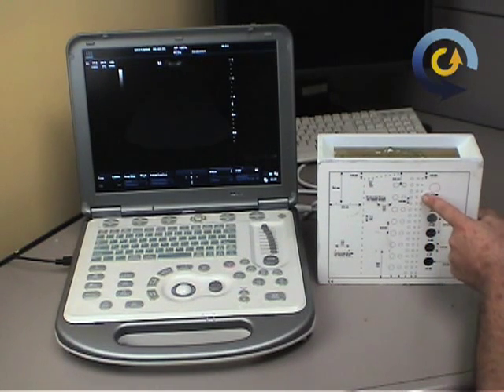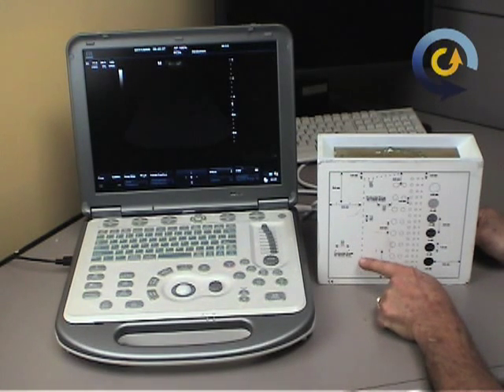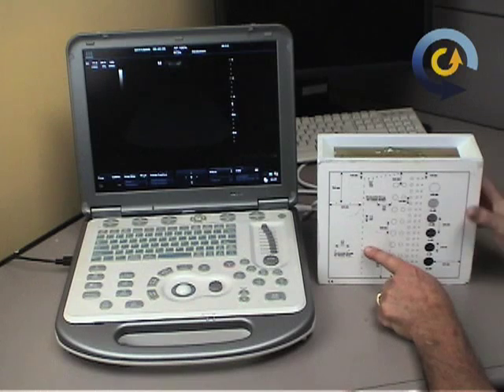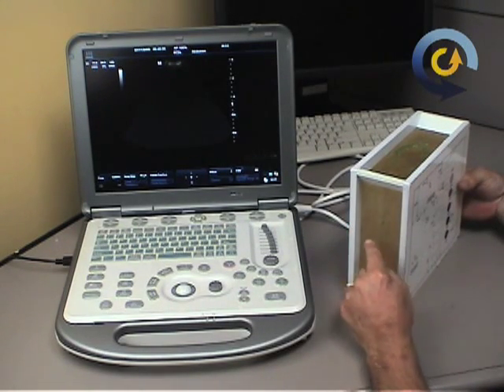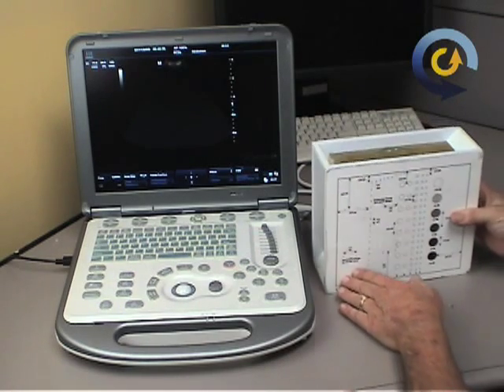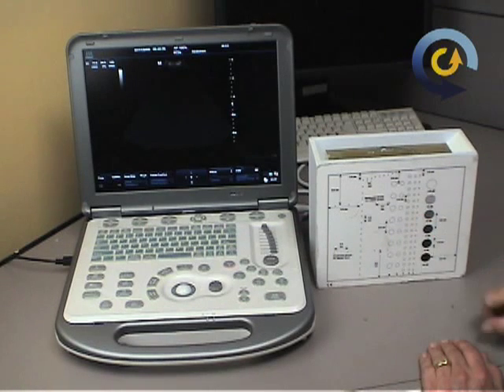Over here, this is the same thing, only these rods are all clear. These vary in their density. Over on this side, what looks like pins as you scan the image are actually, again, wires, very thin 1mm wires, typically going through the system this way. When you scan in the plane this direction, what you get is an image that looks just like this.